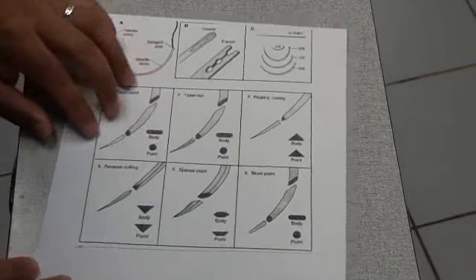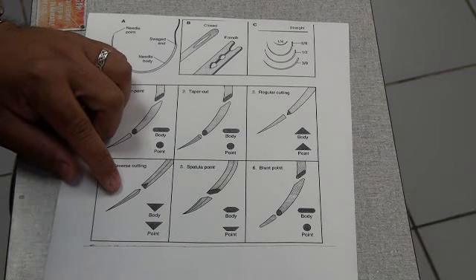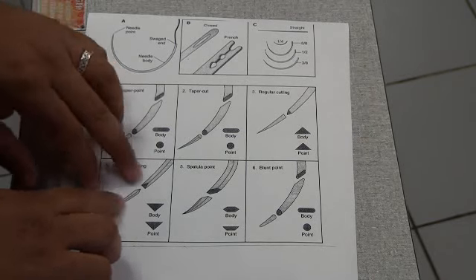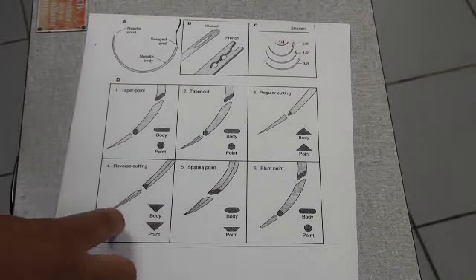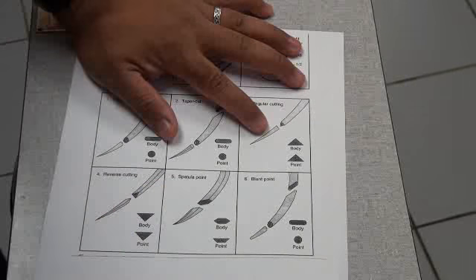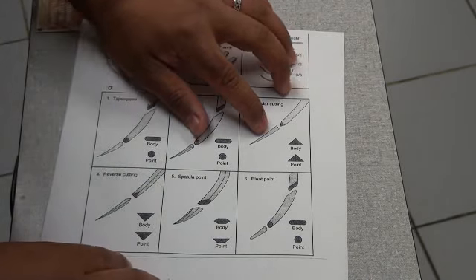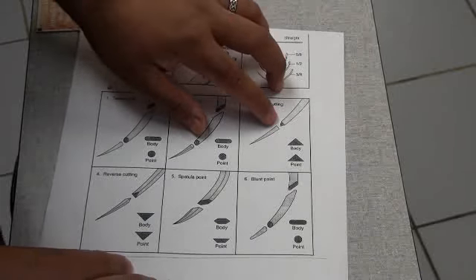The reverse cutting needle here has a sharp point and 3 cutting edges. It has a triangular cross section, and the outside curve is the cutting edge. A regular cutting needle is similar to the reverse cutting. It has 3 cutting edges, but the innermost curve, the inside of the curve, is actually the cutting edge on this one.